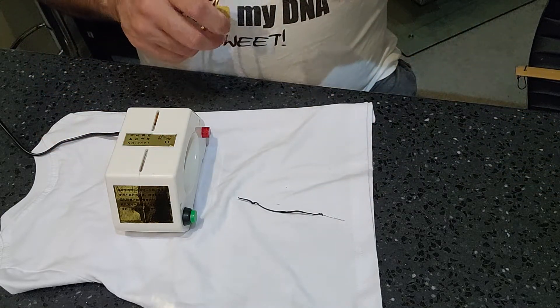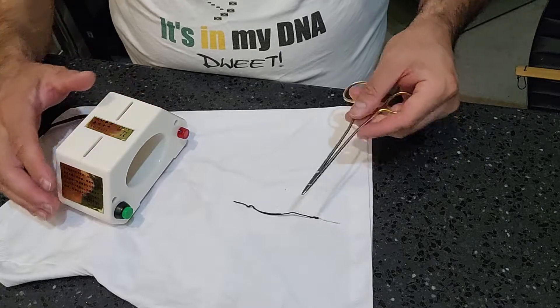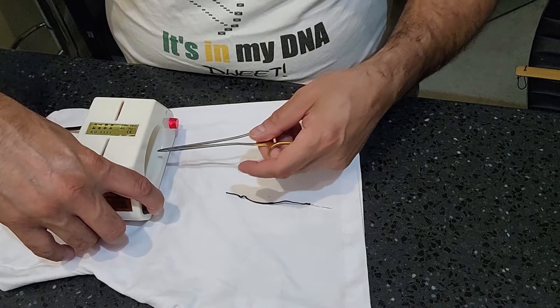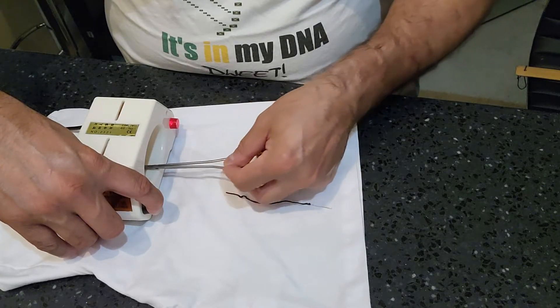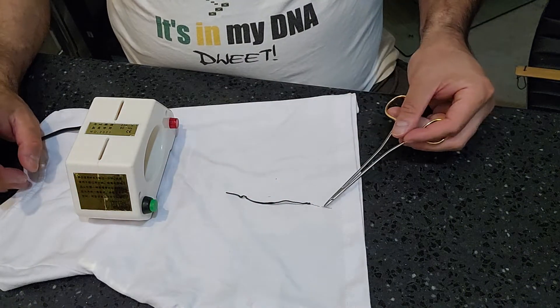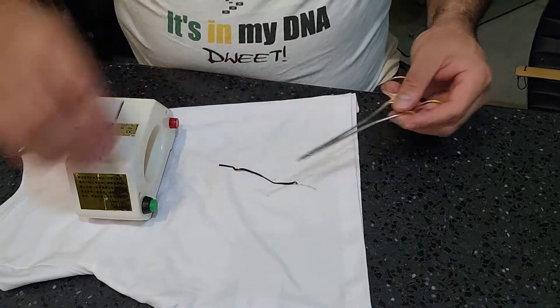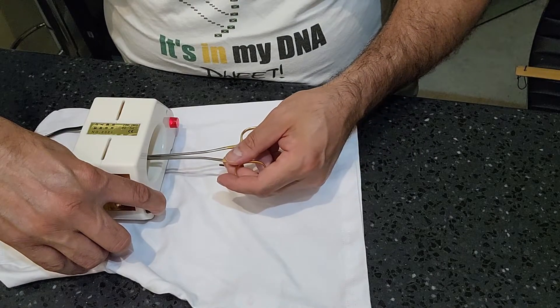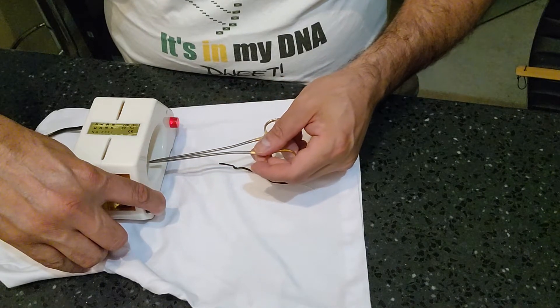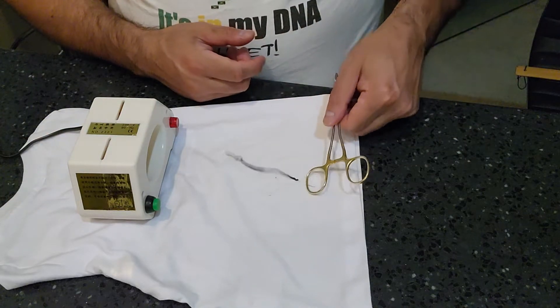If you touch the plastic on this, I'm going to show you guys. This is still cool to the touch and it's demagnetized right now. But if I touch the actual plastic while this is on — see that? I actually magnetized the instrument. So it's important that if you're demagnetizing an instrument, you do not touch the actual plastic. And there you go — demagnetized all the way through. That's pretty cool.